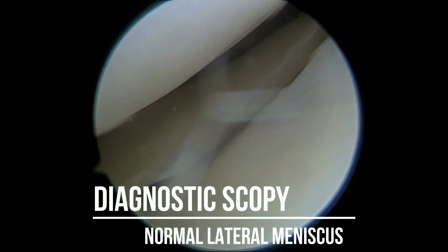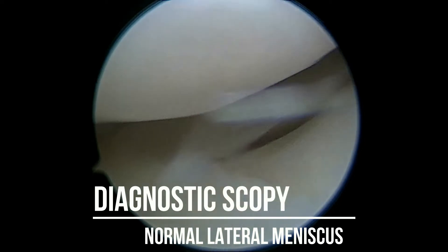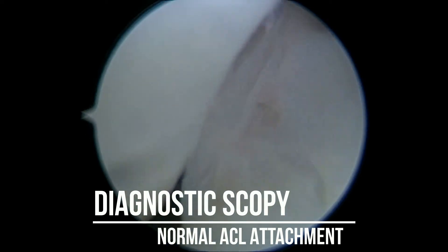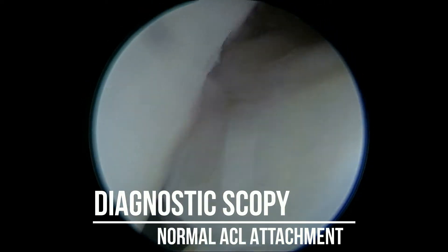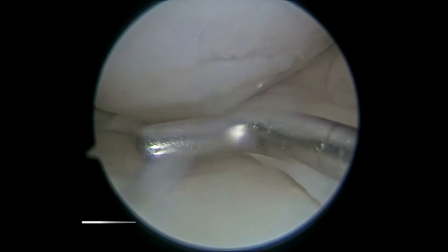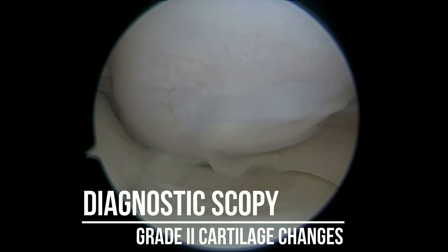In the second part of the diagnostic arthroscopy, we see that the lateral meniscus is completely normal. Moving to the ACL attachment and its root on the lateral femoral condyle, we can see that the ACL attachment at the femur is completely intact. Coming back to our medial compartment, we continue the assessment.